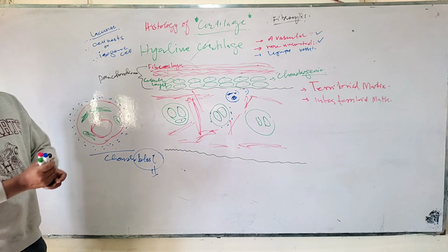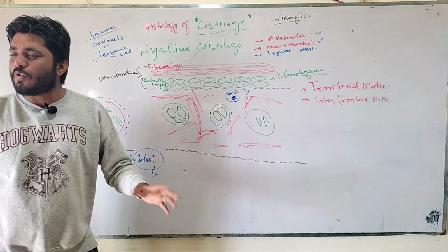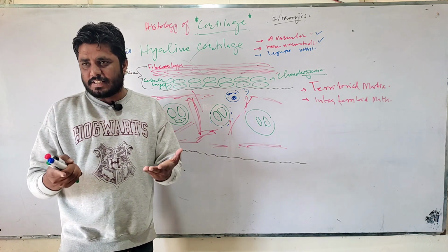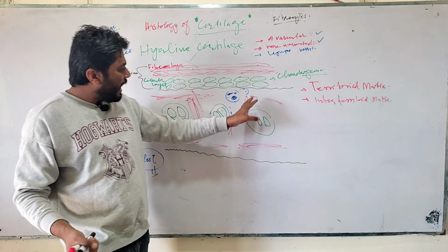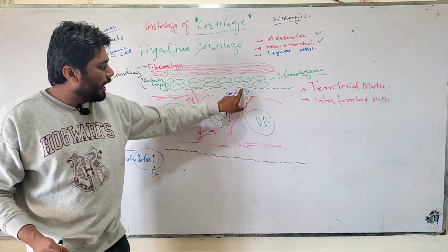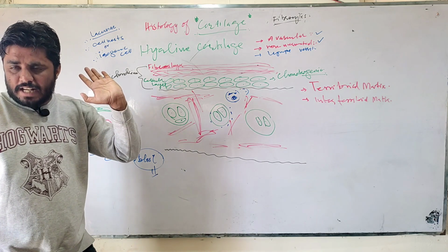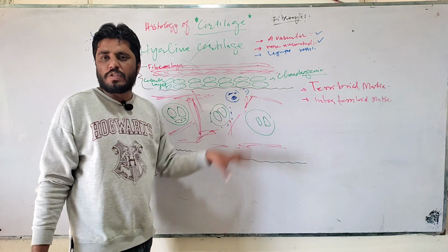This is known as lacuna. So people will call it like that. Chondroblasts or chondrocytes are in lacuna. If you read a good book, they may write this. If they are in lacuna, that means they have a white space here. This is due to the histological tissue preparation. This happens in other tissue also. So lacuna is a histological term, I believe. That's clear. It is a white or empty area around the cell.